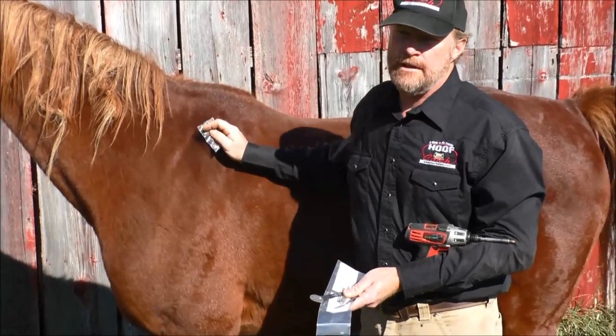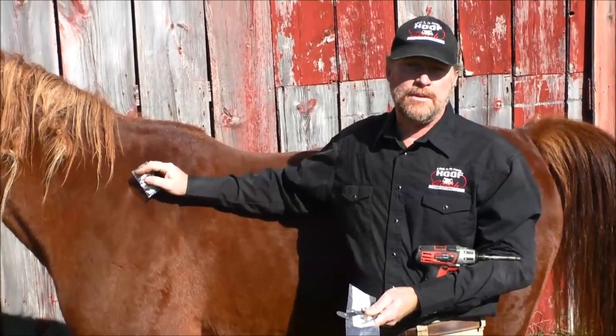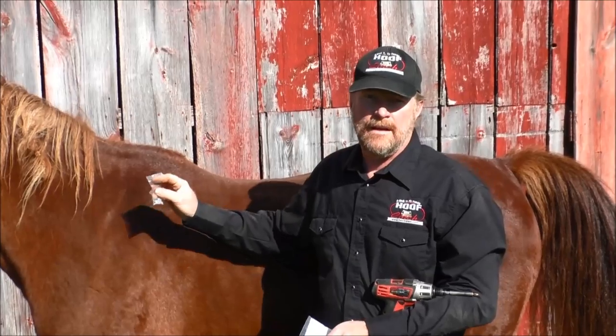This is a standard size that we're going to put on this horse here. This horse is a previous founder that we've already fixed with the hoof cinch, but we use him to do the modeling for us.